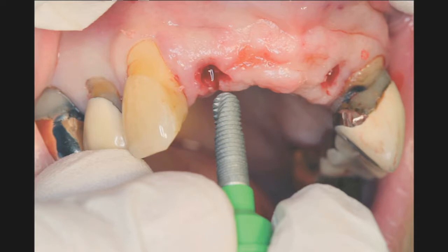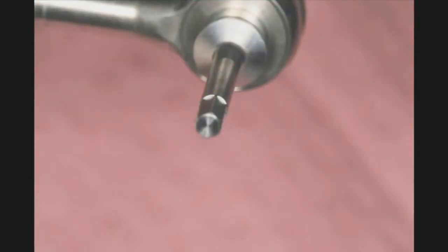We remove that surgical guide and we can see our osteotomy sites in place, and we're going to place our Glidewell implant into the osteotomy site. We're simply hand tightening it to get it started, and then we use an implant driver with a torque wrench for final torquing down or seating of the implant. Note that one of the flats of the internal hex of the implant should face towards the labial. This will give us our best aesthetic final result. And this will eventually match the orientation of the implant analog in the model. So you want the flat side of the internal design of the implant to face towards the labial or facial.